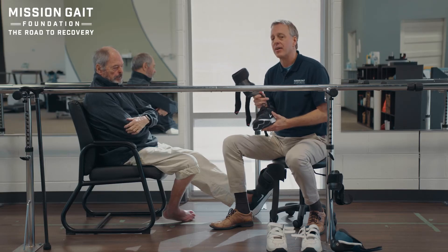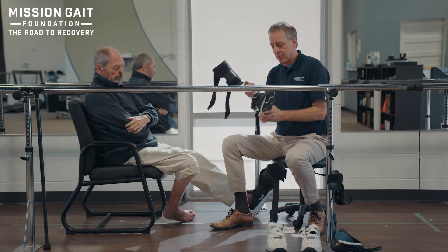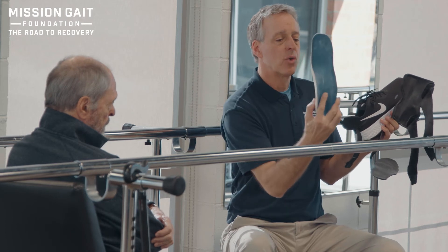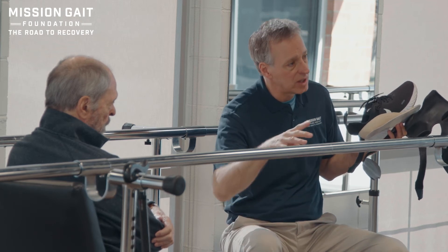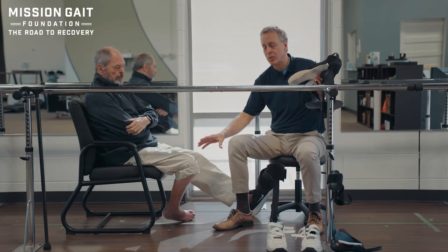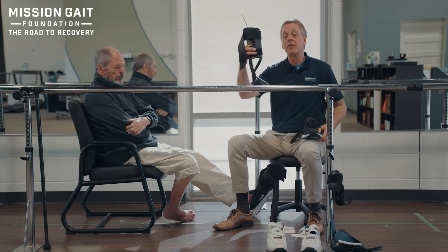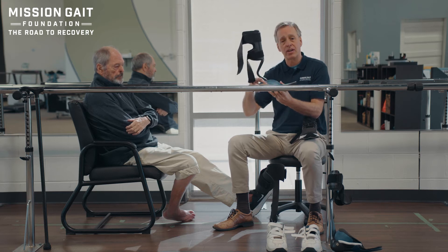Now we're looking at some different AFO styles - both how to put them on and their utilization. Remember, with a solid carbon fiber plate, we want to put something on top to pad the person from the device. Here we have a custom molded orthotic - quite a bit larger because we have not only drop foot control issues but really loss of motor control from the knee down in an inherited neuropathy situation. So we need to stabilize that foot with a better insert, using a plate with a front plate orthotic, which gives a lot more vertical lift along with stabilization.